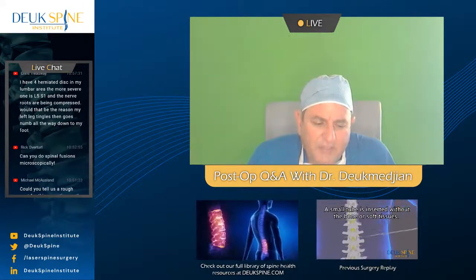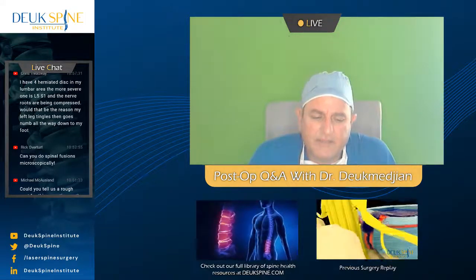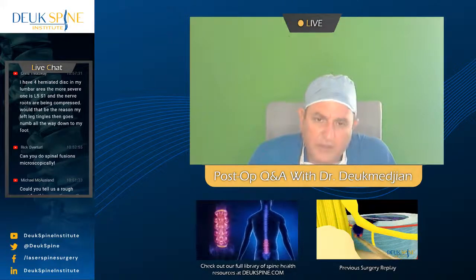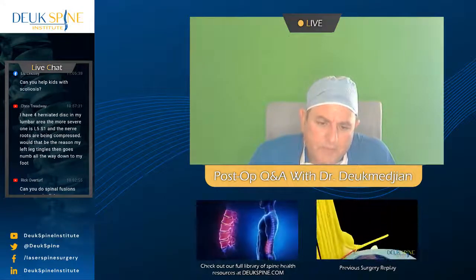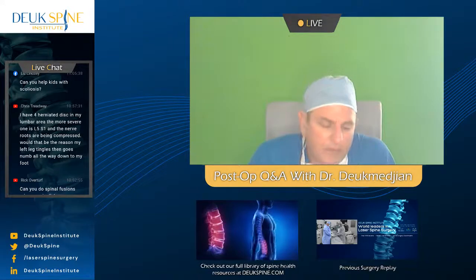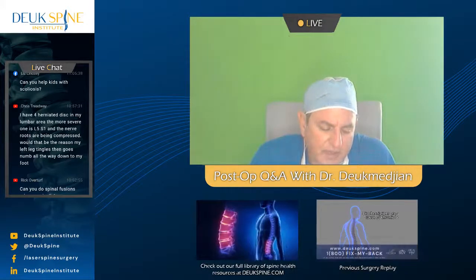If you have a degenerated disc and no deformity and minimal to no stenosis, then yes, I could do a transforaminal endoscopic fusion. I use something called the OptiMesh cage. I was the first one to do it. I did it before it was FDA approved. I did it about 2006. So what is that? 15 years ago, I was the first to do it. And I use what are called transfacet pedicle screws, which are these nifty little percutaneous screws that you can put in to lock the facet at the fusion zone together.